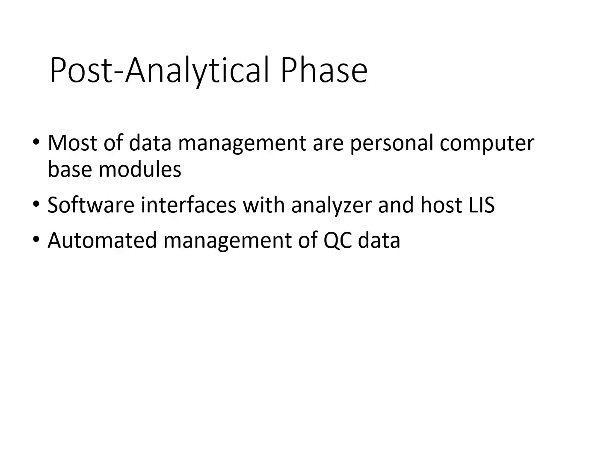And then we have post-analytical. Some features of this is the data management systems. Most post-analytical processes are going to be handled by personal computer-based modules, which are designed specifically for data management. We have software integration. So these systems interface directly with both the analyzer and the LIS to ensure smooth transfer of that data. We have automated quality control management a lot of times now as well.